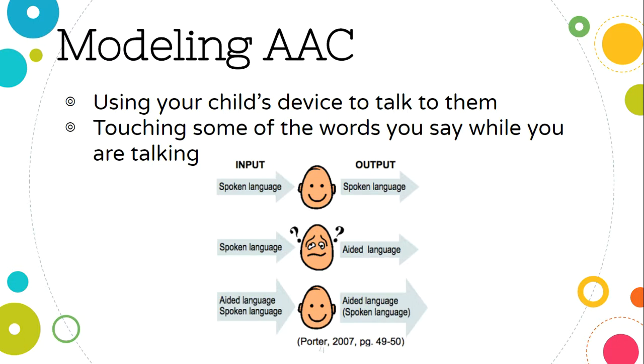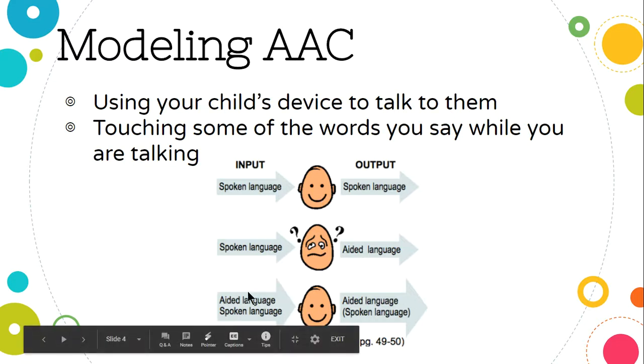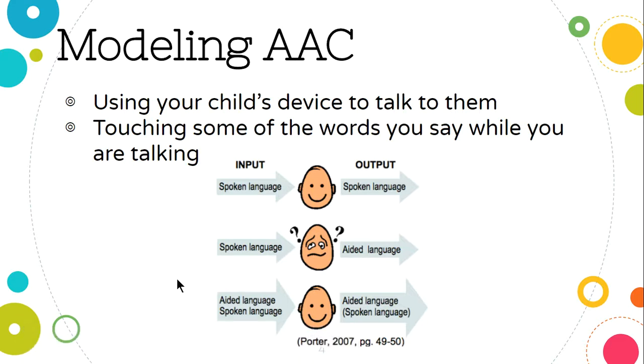We do have research that shows that students who use AAC devices do increase their spoken output because students are always going to communicate in whatever is the easiest way possible. So, as they gain more speech, they're going to speak some of those things. So we want to make sure that we're providing that modeling. So you're just going to touch some of the words you say while you say them. You do not have to touch every word you say. If you try to do that, you will go a little bit crazy, especially trying to keep up grammatically. So please don't feel like you have to do that. Right now, this is something that's new and it's new for your child.